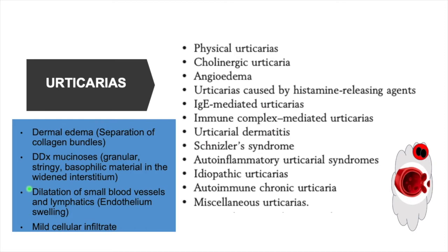So if you look on high power, you will see endothelium swelling. And the infiltrate will be mild. You will not see a lot of inflammatory cells. Mostly you will see eosinophils and a lot of edema, especially around the vessels.